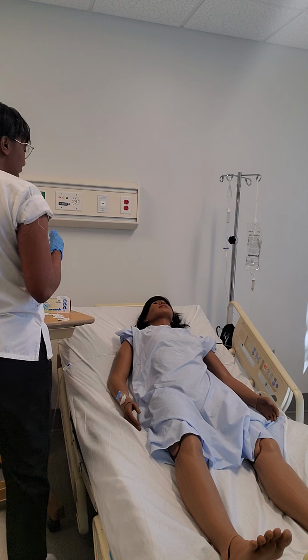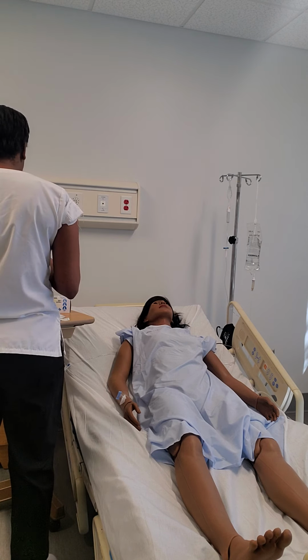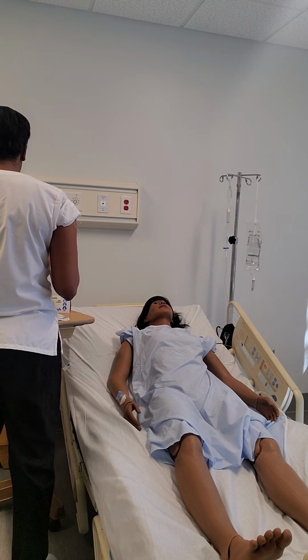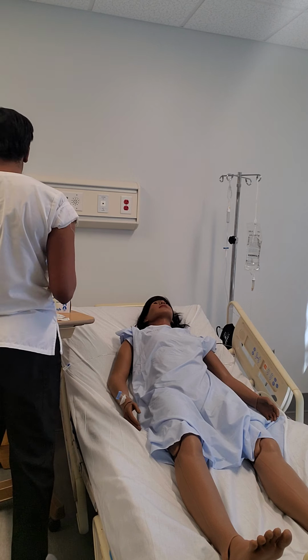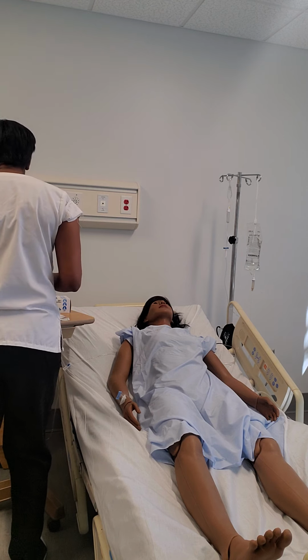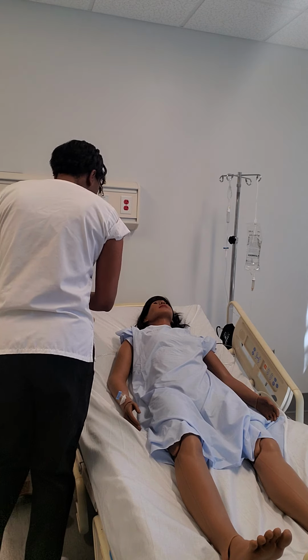So I've done my 6 rights. I've made sure that I have the right patient by verifying on the wristband, comparing the MAR to make sure I have the right medication, checking the MAR again to make sure I have the right route, which is going to be IV push, the right dose, which is going to be that 4 milliliters to equate to that 20 milligrams, the right time. I've made sure that this was the appropriate time to give the medication, and then I'll make sure I properly document it afterwards.